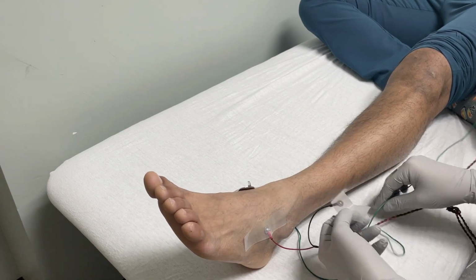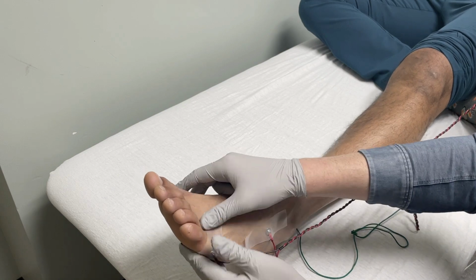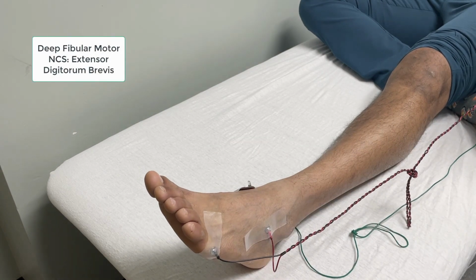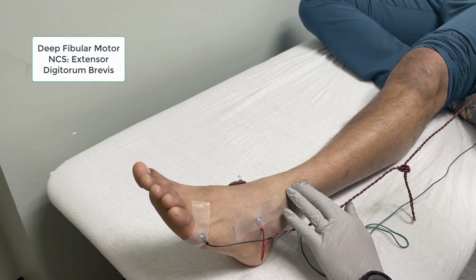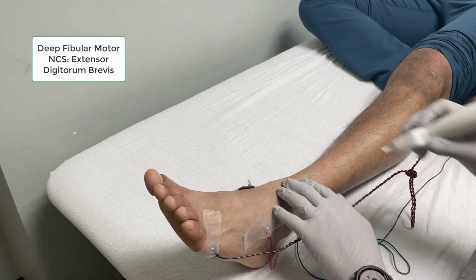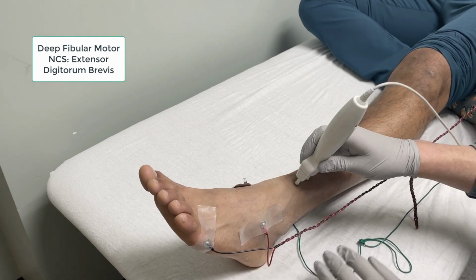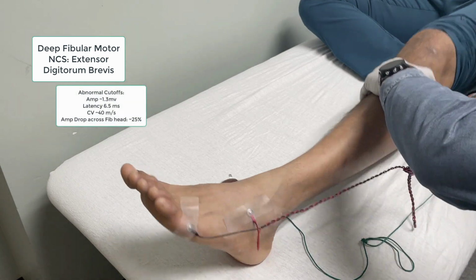Motor nerve conduction study to the extensor digitorum brevis is completed by placing the active electrode over the midpoint of the extensor digitorum brevis muscle on the dorsum of the foot. The reference electrode is placed slightly distal to the fifth metatarsophalangeal joint, the MTP joint. The first recording site for EDB is found by measuring 8 centimeters proximal to the active electrode, slightly lateral to the tibialis anterior tendon.